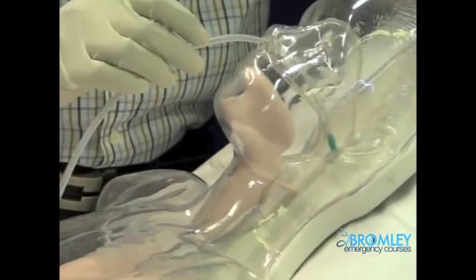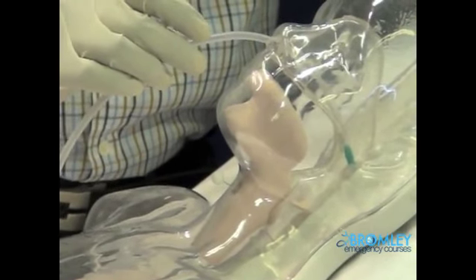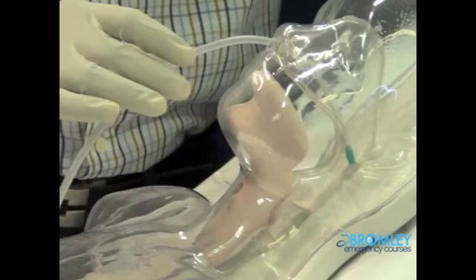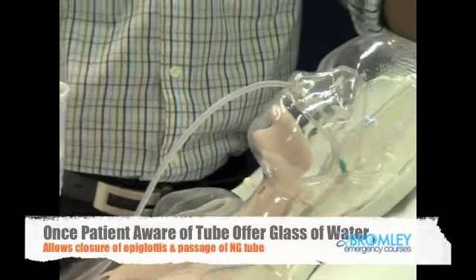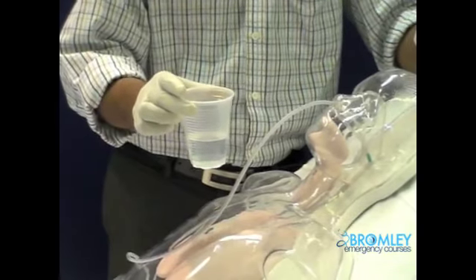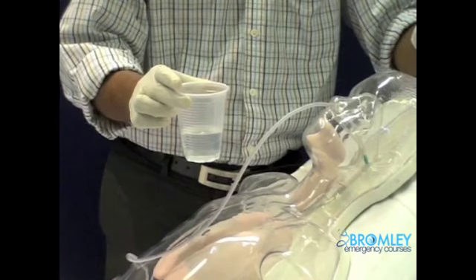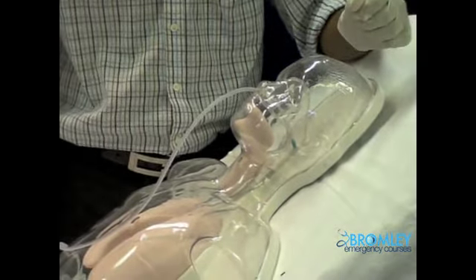Now once the NG tube reaches the pharynx, the patient will start having the cough or the gag reflexes. You might offer the patient a glass of water to swallow. That helps us to insert the NG tube into the esophagus rather than into the trachea.